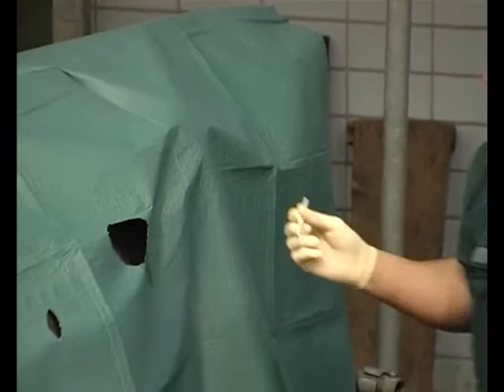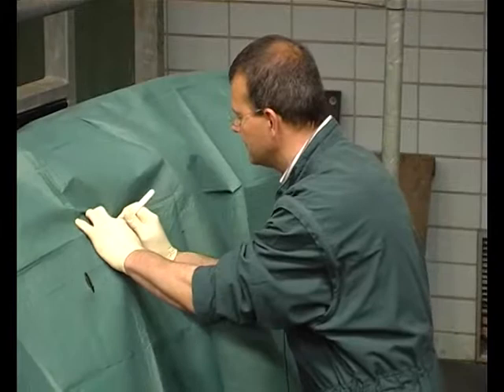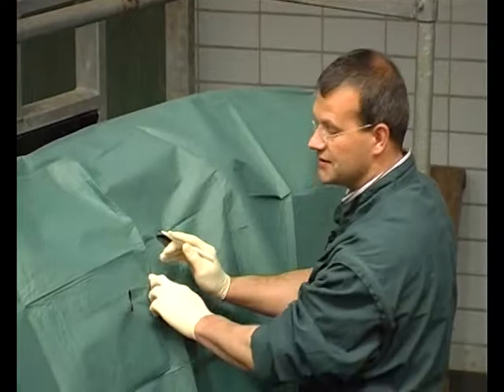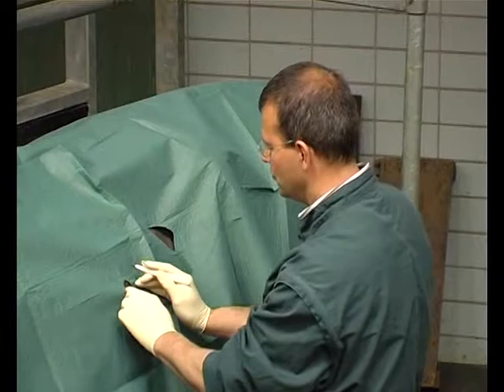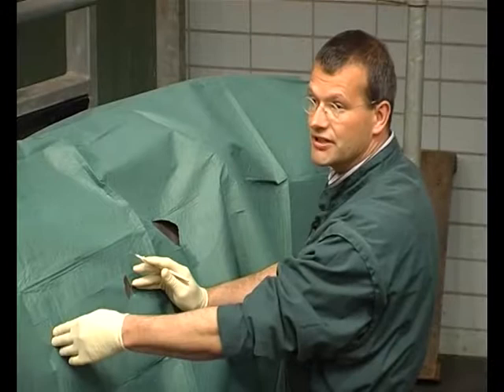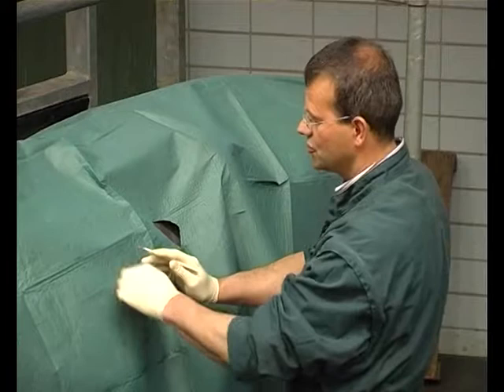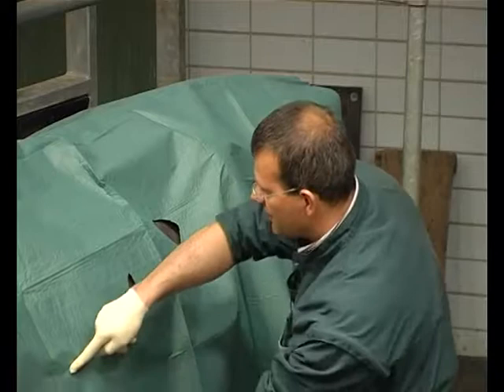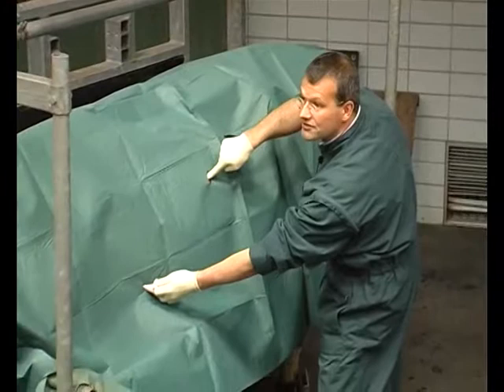Then the first incision is directly behind the last rib, and the second position is in the 11th or the last intercostal space. It's important to take this position because you cannot identify the end of the diaphragm. So if you go with this position more cranial, it may be that you puncture the lung. Not too much cranial and not too much dorsal here. The projection of the lung is in this direction, and you have to be behind the projection of the lung here, okay?